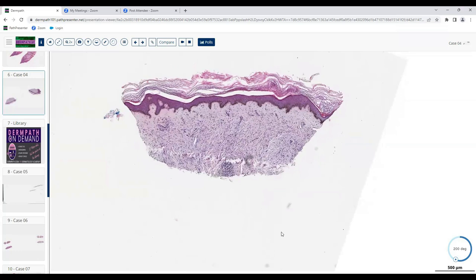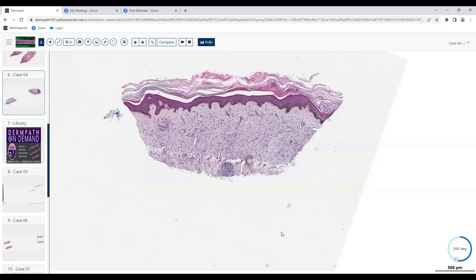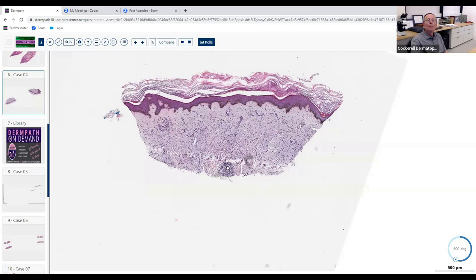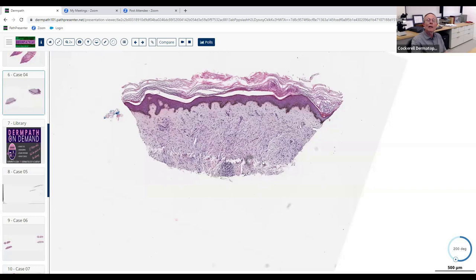Maybe fibrohistiocytic — well, that's more of a differentiation. The pattern is superficial and maybe perivascular. There's a little perivascular inflammation — I agree, superficial and maybe even deep. But what about between the blood vessels? There was a lot of mucin — yes, you can see it at low magnification as a pale bluish-gray color. And the fibrohistiocytic cells — how are they arranged?